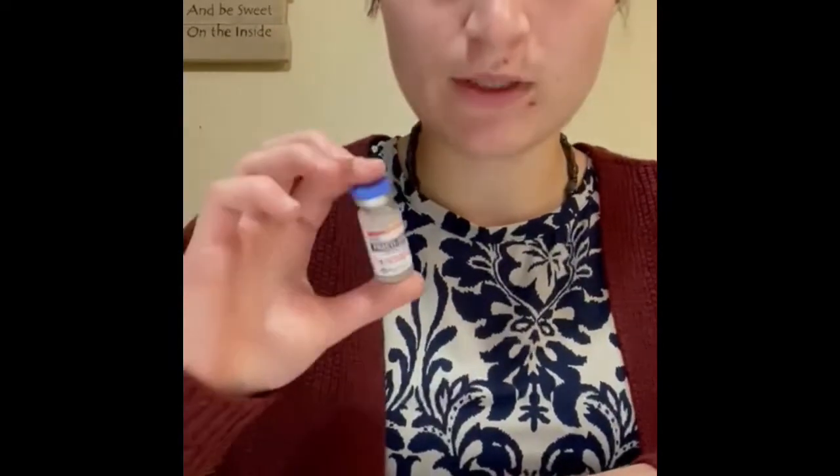It says furosemide 20 milligrams, IV infusion, and we've gone to our IV guidelines, and we've come up with the amount that we will need 12 of these to equal 48 mLs injected into our 100 ml of normal saline. So that's my first check, making sure all these vials are the same. And then I'm going to move ahead.